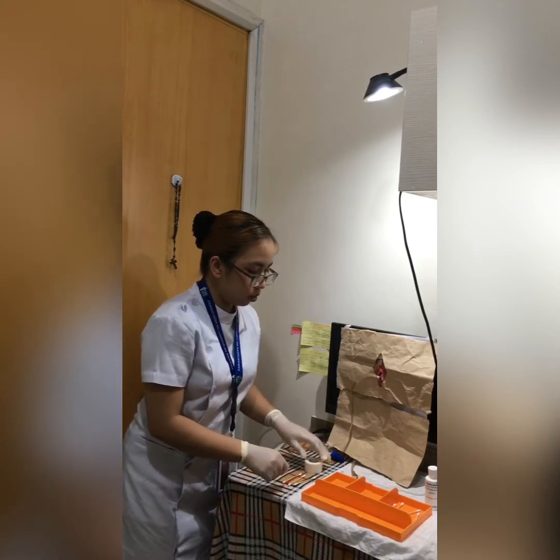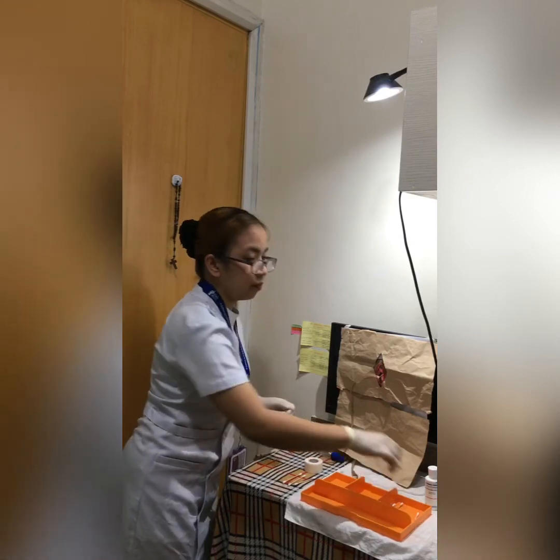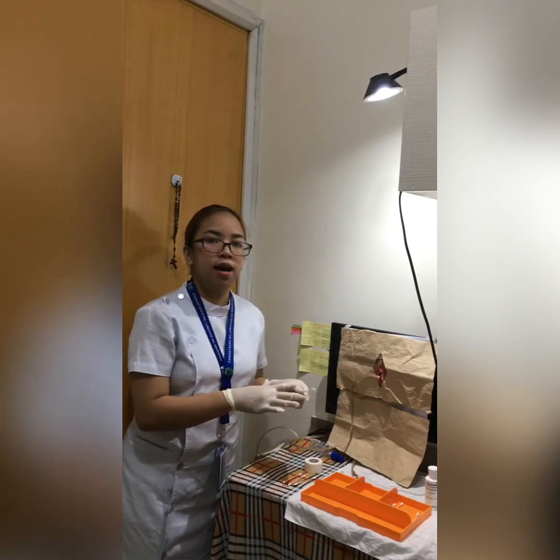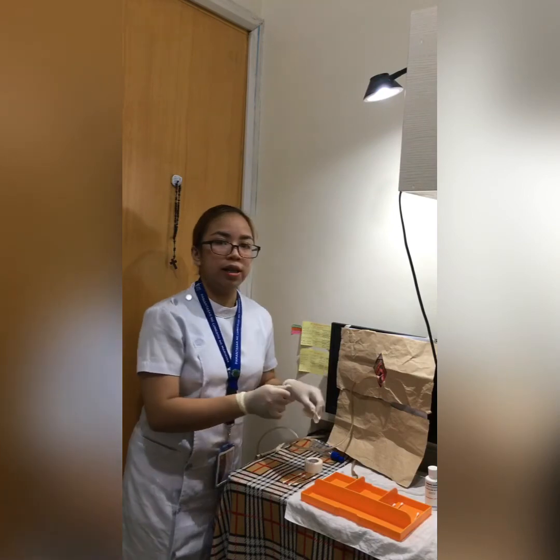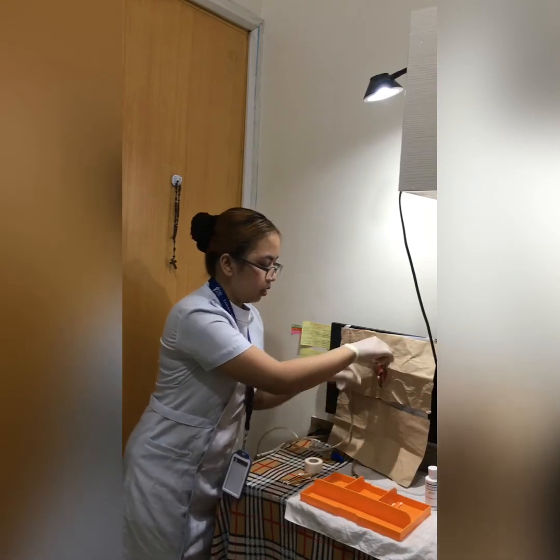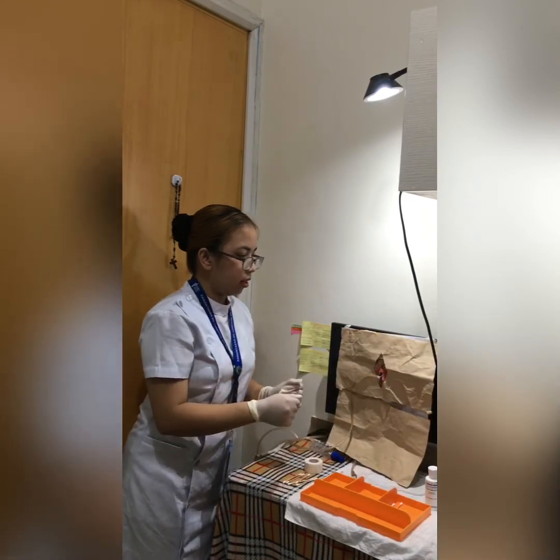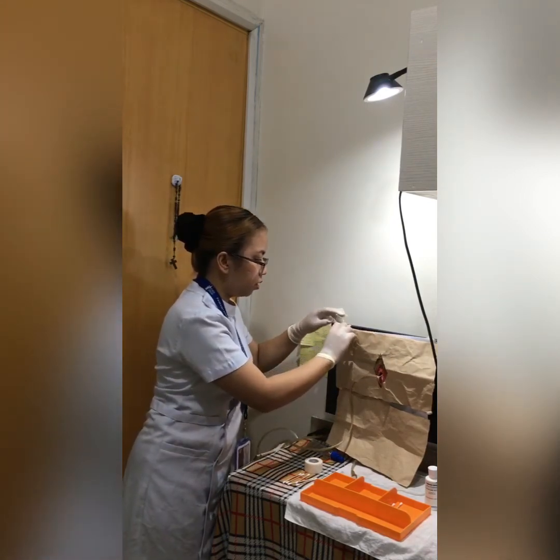Next, we're going to clean the area that may have excess lubricant or spilled urine. Then after that we're going to remove the drapes.